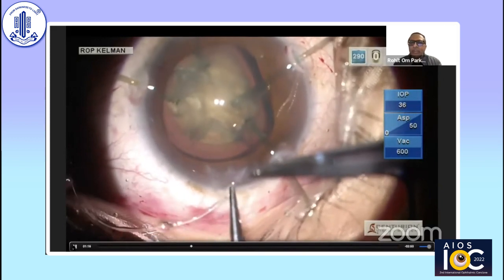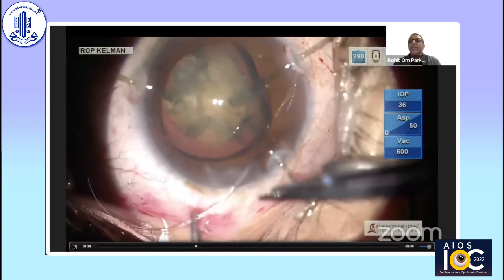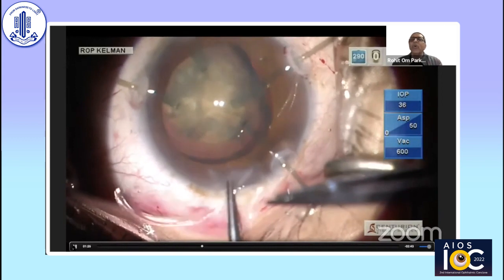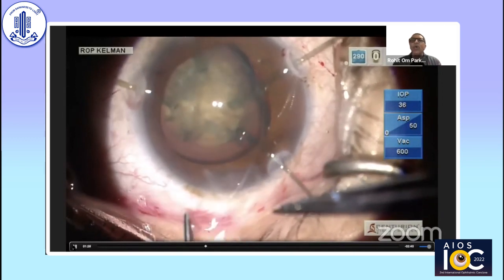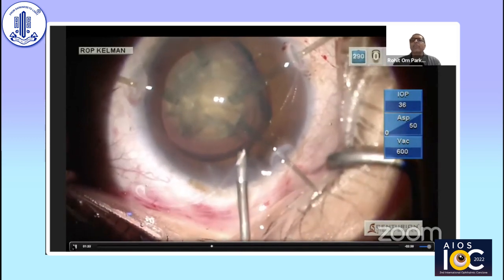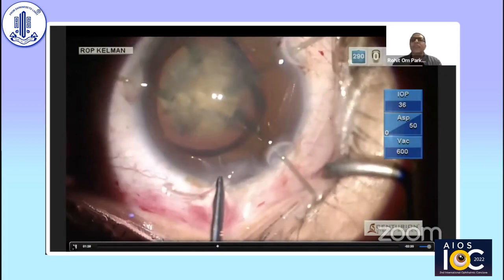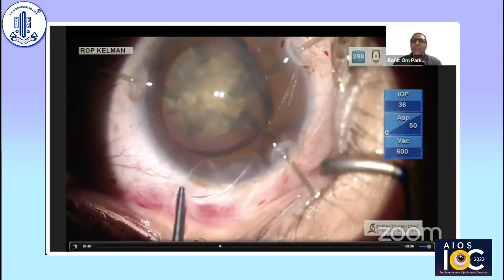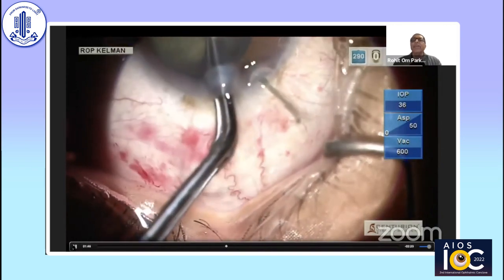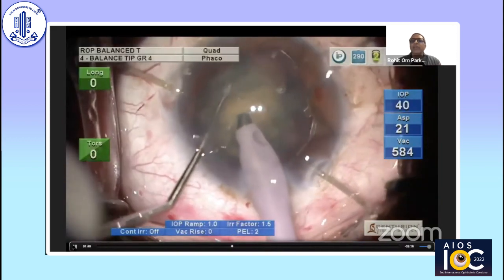The timing of CTR insertion is also very important. Here, I initially thought the nucleus as a whole was not very hard. Had it been very hard, I could have delayed the CTR insertion, because CTR implantation at an early stage is more traumatic than at a later stage. If the nuclear fragment is softer, early insertion should be the first option.